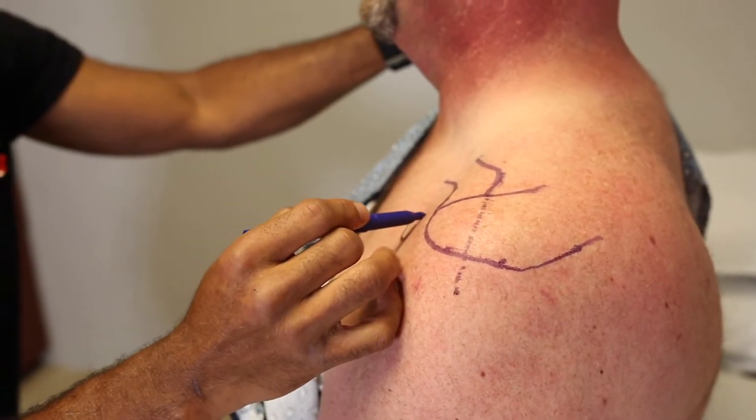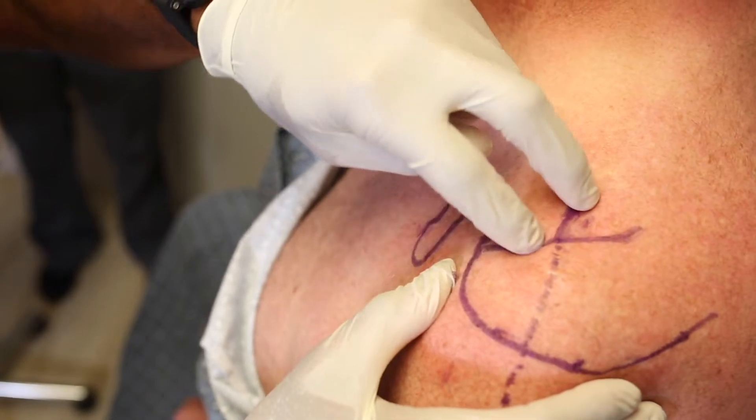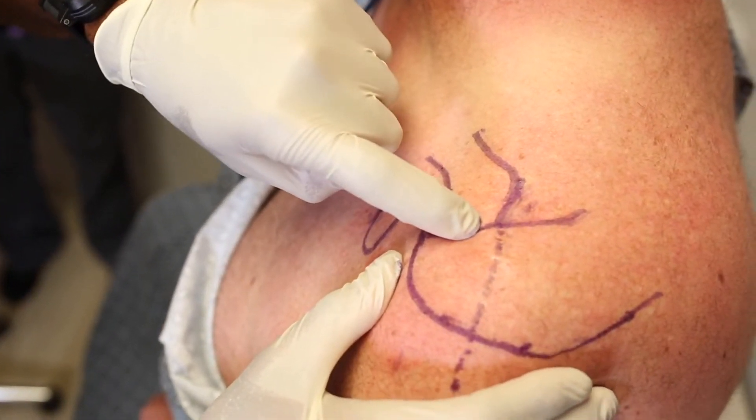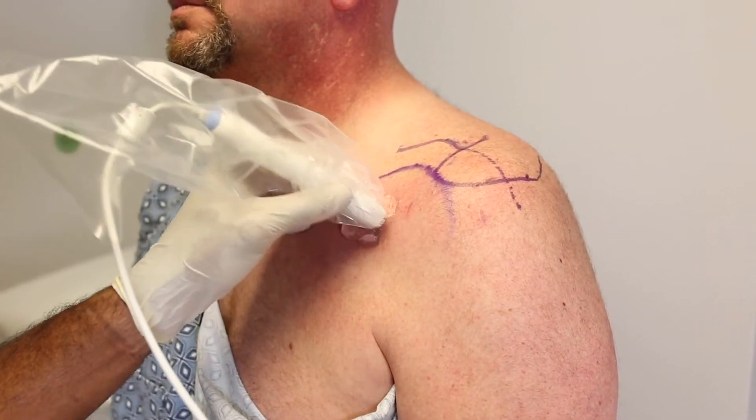We can mark the anterior bursa. And then anteriorly, we're marking the coracoid because we can palpate it. This helps plan our procedure and allows us to place the ultrasound transducer directly over the coracoid.